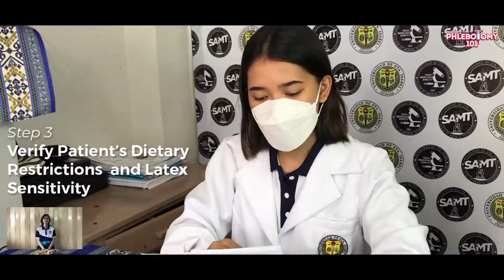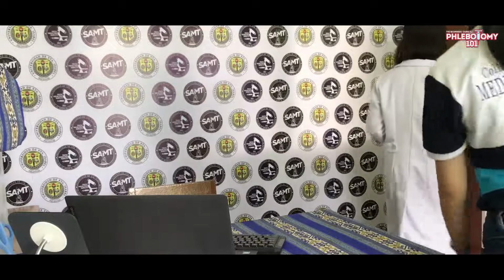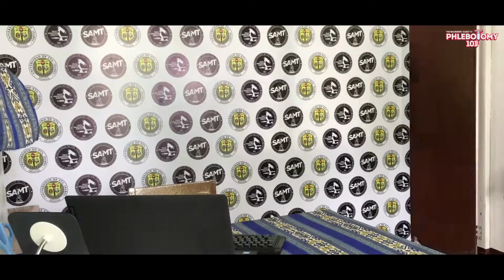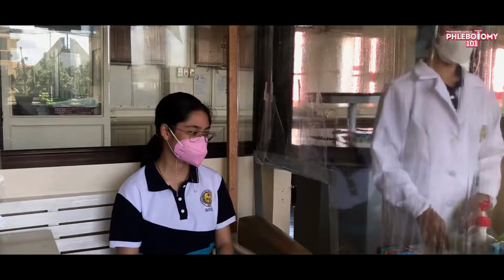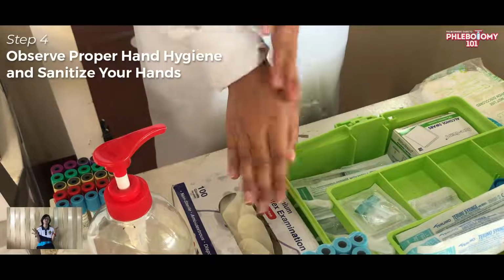For the third step, we need to verify the patient's dietary restrictions and latex sensitivity. Siguraduhin latex-free equipment ang gagamitin sa patient and walang latex items sa room kung ito man ay allergic sa latex. Step 4. Observe proper hand hygiene and sanitize your hands.